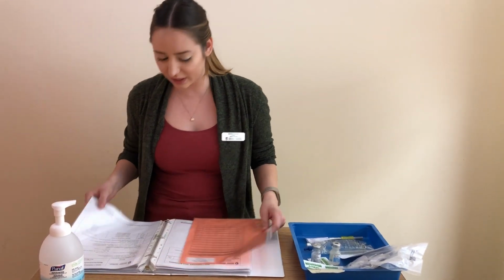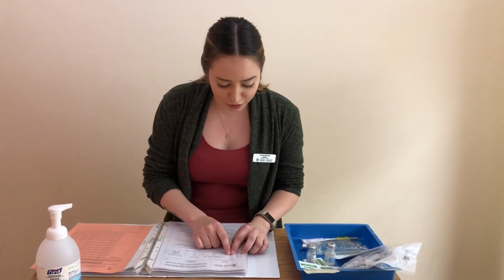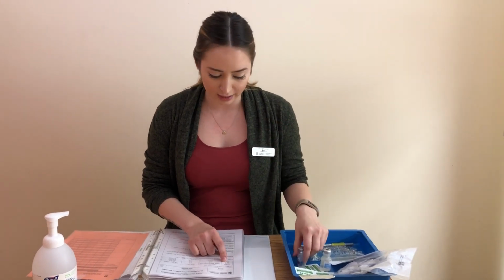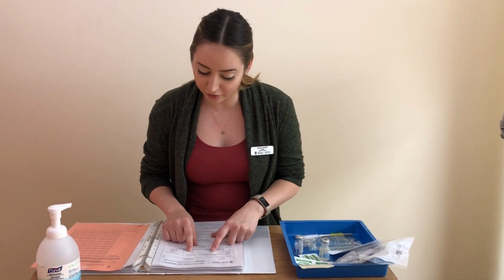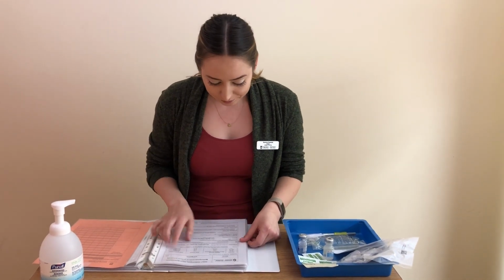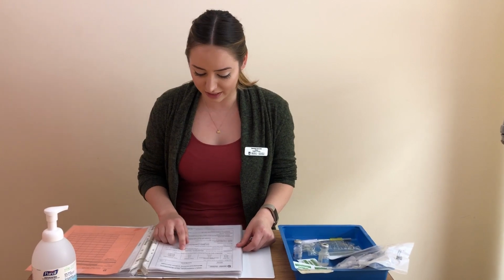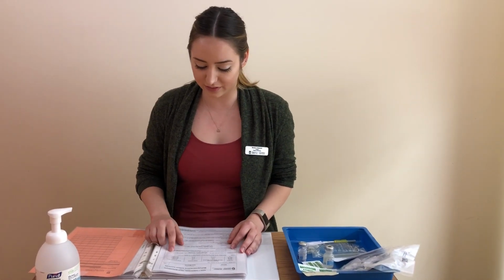And I'm going to look at the reconstitution instructions here and note for a 125 milligram vial, which is what I have here, I'm going to be diluting it with 2 milliliters of sterile water for a final volume of 2 milliliters and a final concentration of 62.5 milligrams per milliliter. I'm also going to note that after I reconstitute it, I'm going to dilute it in either 50 to 100 milliliters of normal saline or D5W.